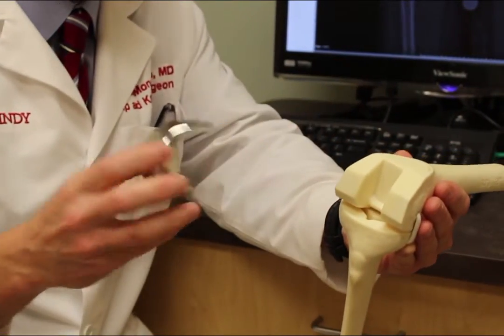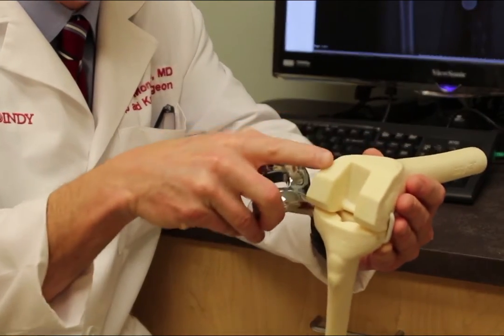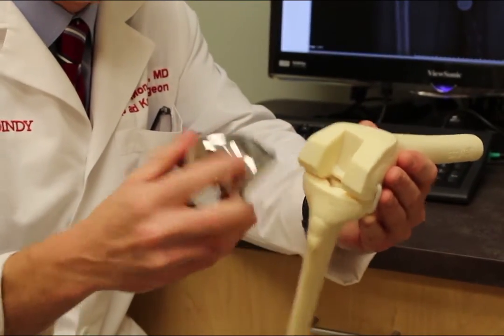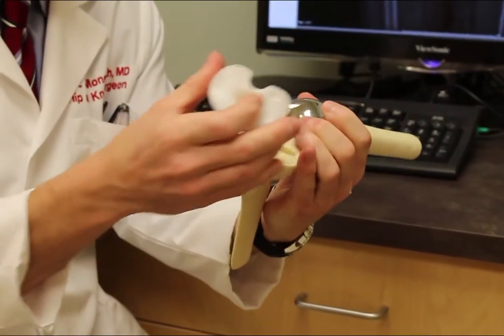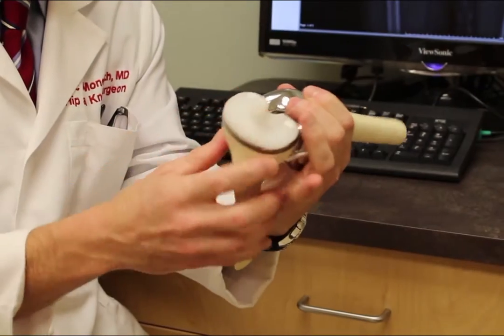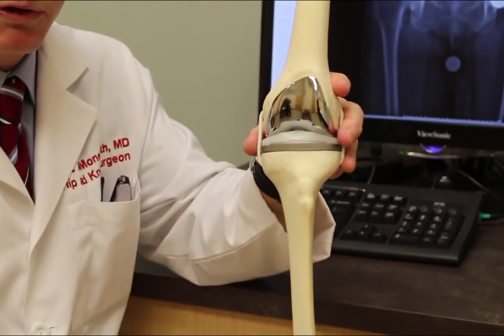On the end of the thigh bone goes a metal cap, again just a few millimeters thick — and these bone cuts are only a few millimeters thick. This is all put on with bone cement in a live person, and that comes together to form your new knee surface.